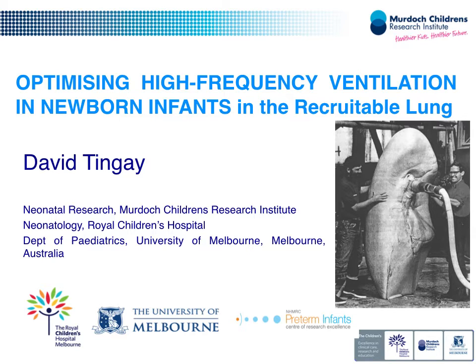So I'm going to talk a bit about optimising high frequency, and I've changed the title somewhat to say in the recruitable lung, because lung recruitment can be only done in a lung that will respond to recruitment. You can't do lung recruitment in a lung that has the wrong disease for that. So we have to be very aware that the rider, the legal disclaimer, is this is an approach to high frequency which is only relevant to lung diseases associated with atelectasis or recruitability.